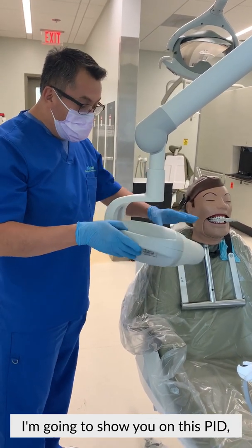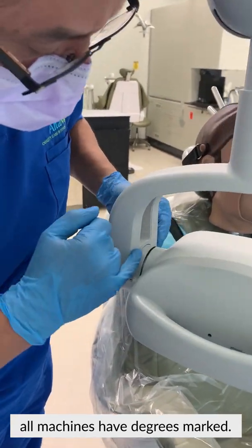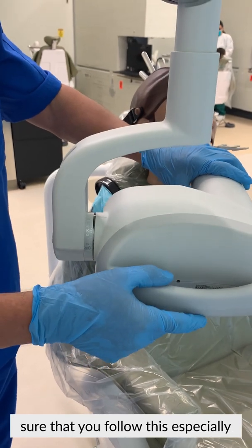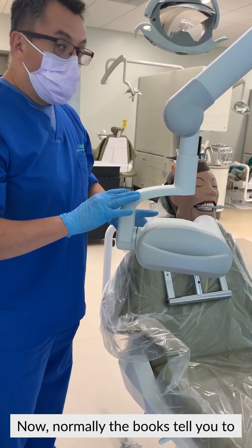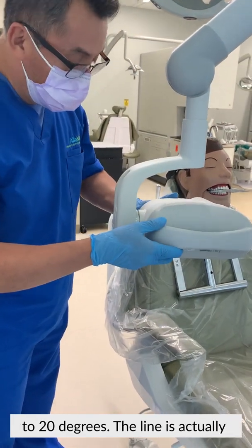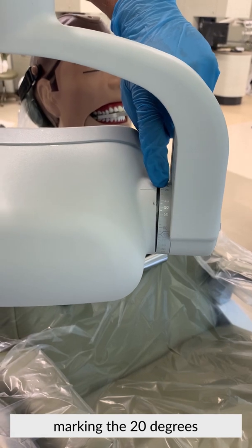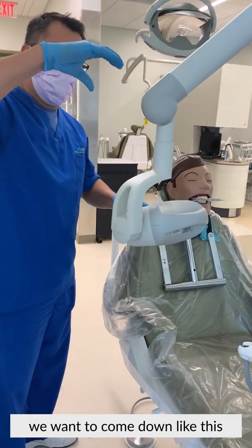Now, real quick, I'm going to show you on this PID. If you come closer, all machines have degrees marked. All machines have a little line to mark the degrees. So right here, what you have to make sure is that you follow this, especially if you need to take an x-ray. Now, normally the books start with the 20 degrees plus. That means that when I set this up to 20, right there, the line is marking the 20 degrees. That means the PID is going down. Why? Because we're on top, we're gonna come down like this.